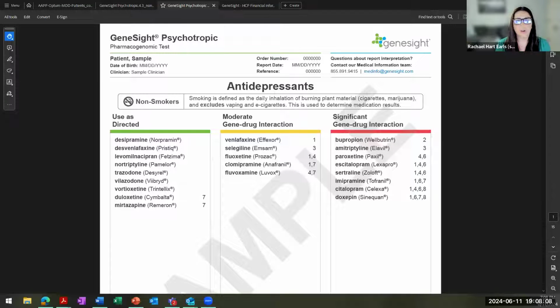I know if you're on this webinar, you're likely familiar with the organization of the GeneSight report, but when a medication is in the green, what does that mean? Genetically speaking, it indicates that there are no variations found in your patient's genes that are expected to impact their outcomes to that medication. However, Dr. Ranchero, I'm interested in what it means to you clinically when you see a medication is in the green category. How do you interpret that?